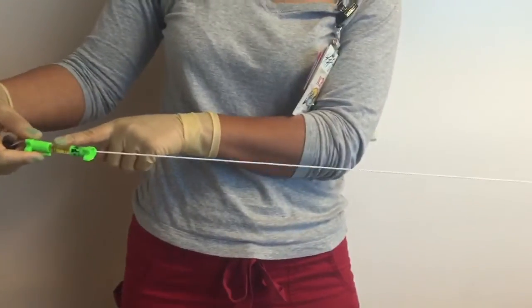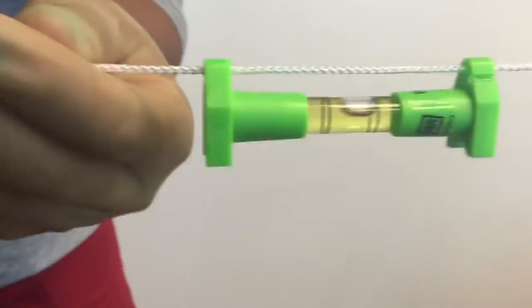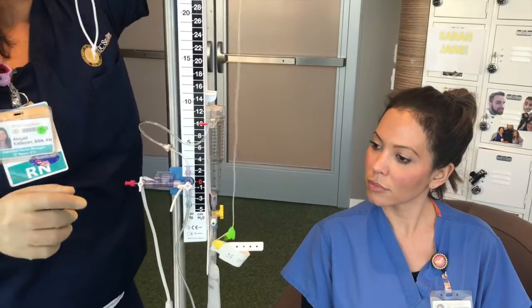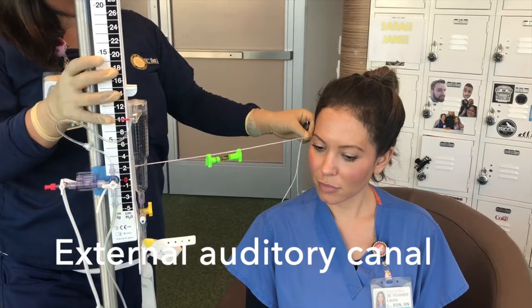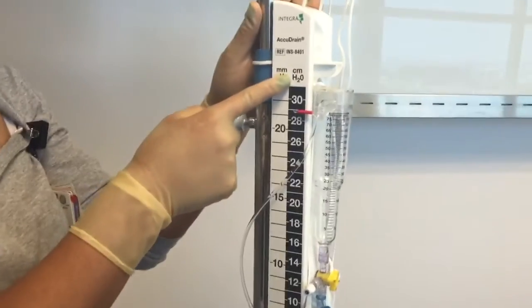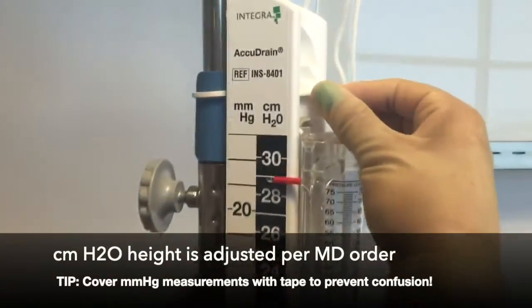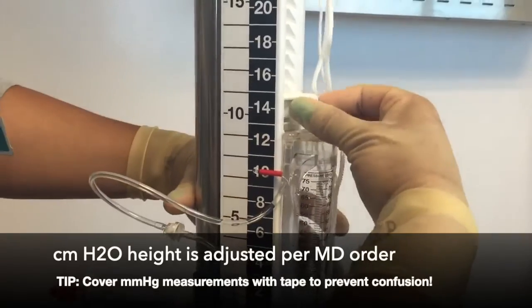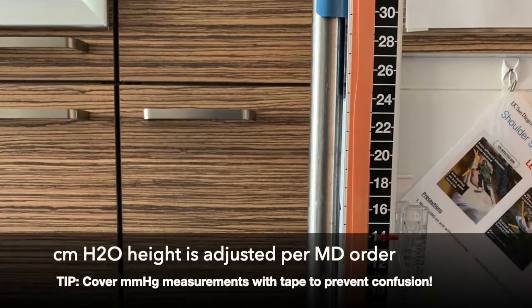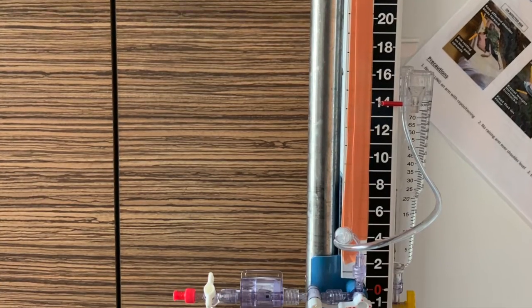Use the line level to level the zero pressure reference point to the external auditory canal of the patient. Be able to differentiate between millimeters of mercury and centimeters of water. Your provider will write orders to the appropriate centimeters of water, and per your provider order, you will adjust the height of your burette or EVD drip chamber using the squeeze lock tab.